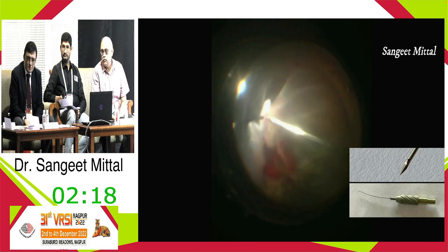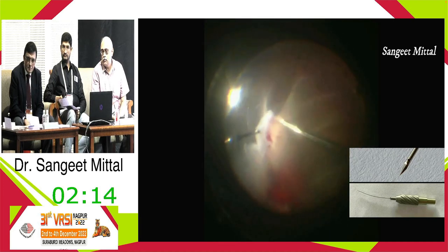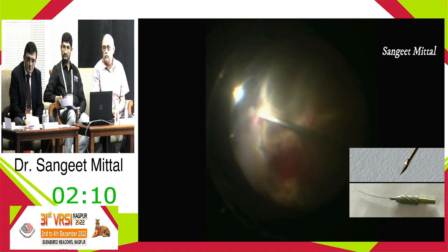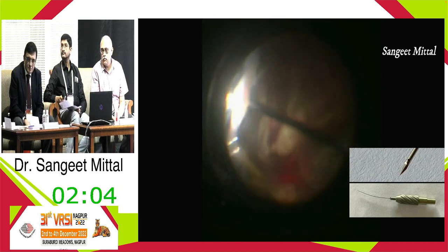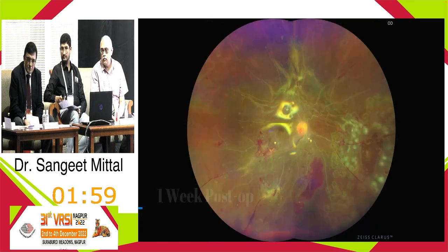The disposable needle can be connected to the extrusion pump with a reusable handle. This is helpful to remove excessive blood during dissection and to perform hydro or visco dissection. Because the dissection is done using simple to and fro motion, the membrane removal can easily be done by the non-dominant hand also. The long and curved shaft protects the lens and the retina from injury during dissection.